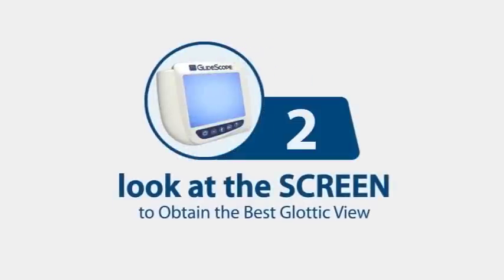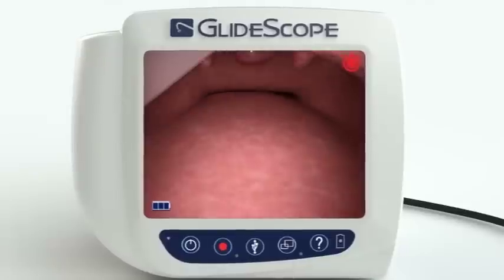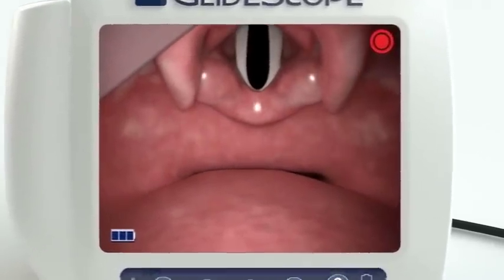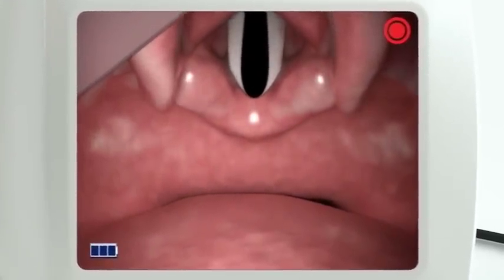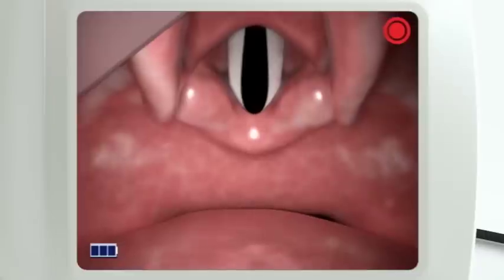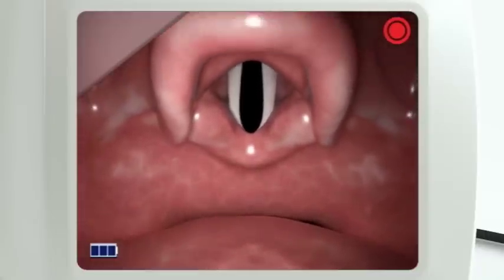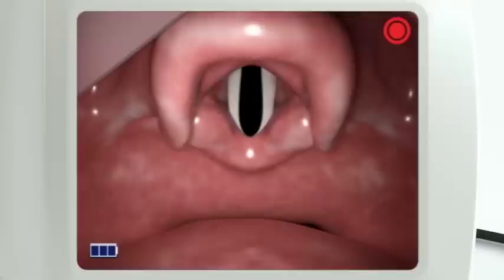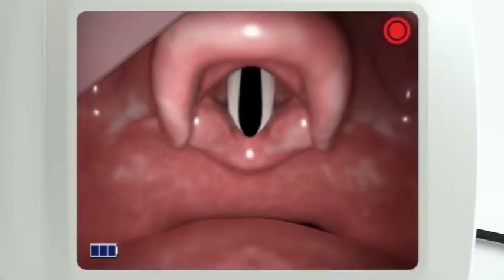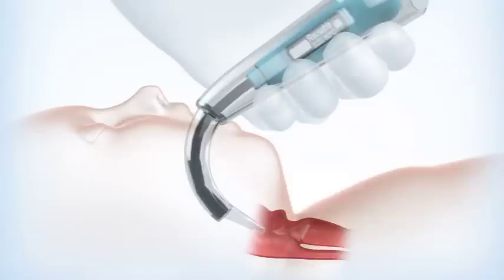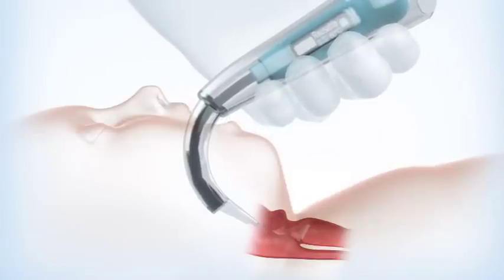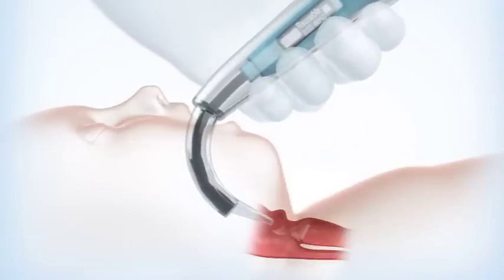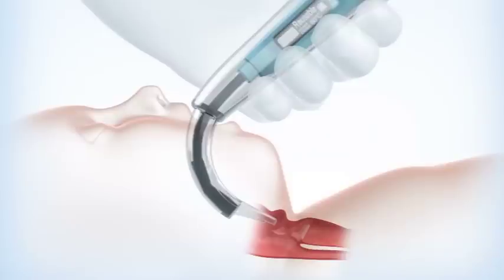Step two is performed while viewing the video monitor the entire time. With the GlideScope inserted, look to the monitor to identify the epiglottis. Sometimes a slight withdrawal of the GlideScope is required to reduce the viewing angle and allow the glottis to drop. Then manipulate the scope to obtain the best glottic view. The glottic view is optimized by a combination of advancing or withdrawing the laryngoscope slightly, while increasing the tilt to seat the device in the vallecula or on the posterior surface of the epiglottis, to obtain the best glottic view.